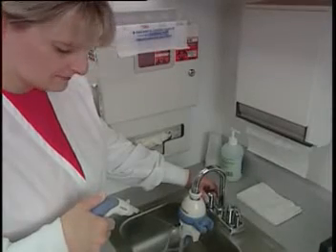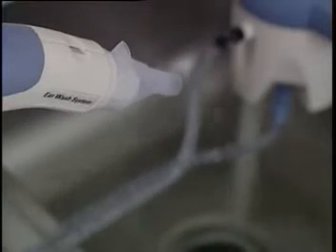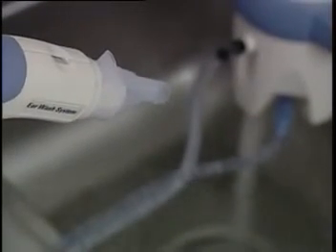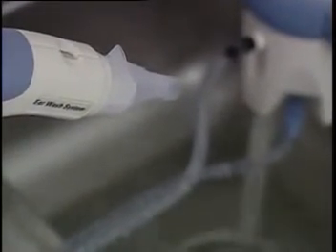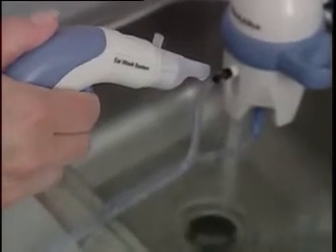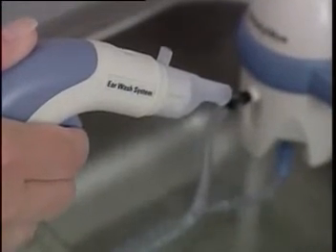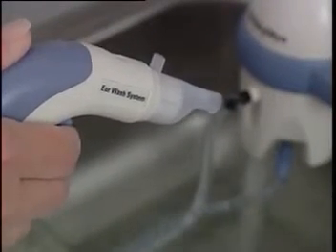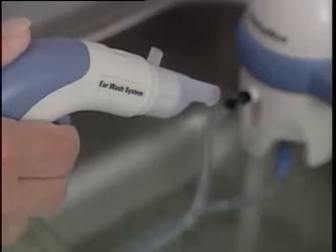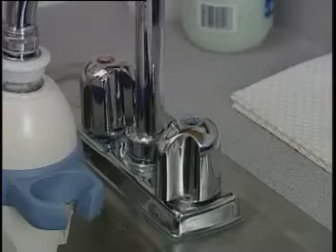If the water temperature ever reaches 110 degrees, the pressure chamber will automatically restrict the flow to the handle, so there's no danger of tissue damage if the water gets too hot. If this happens, water will continue to discharge out of the bottom of the unit. So if you're pressing the actuator and there's no water coming out, chances are that the hot water shutoff system has been activated. For the unit to reset, the water temperature must be brought down to a safe level.